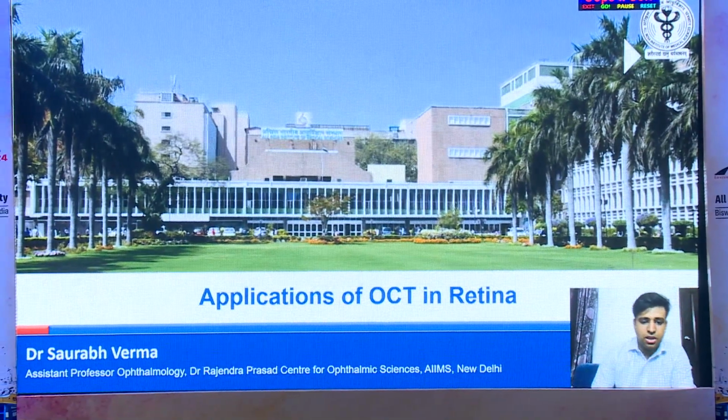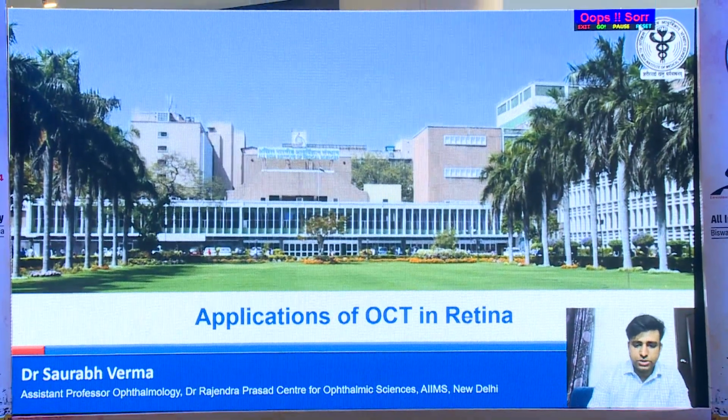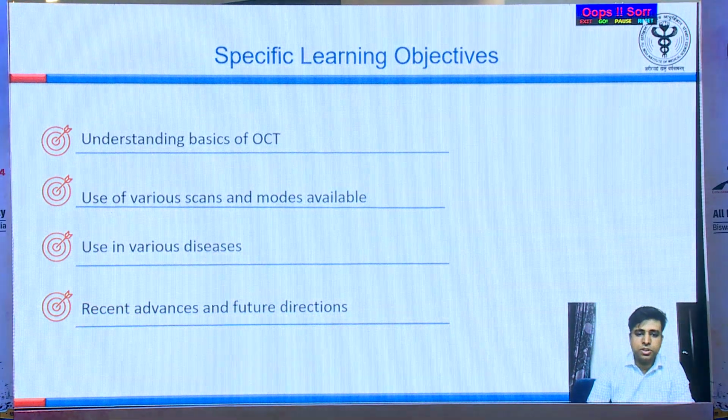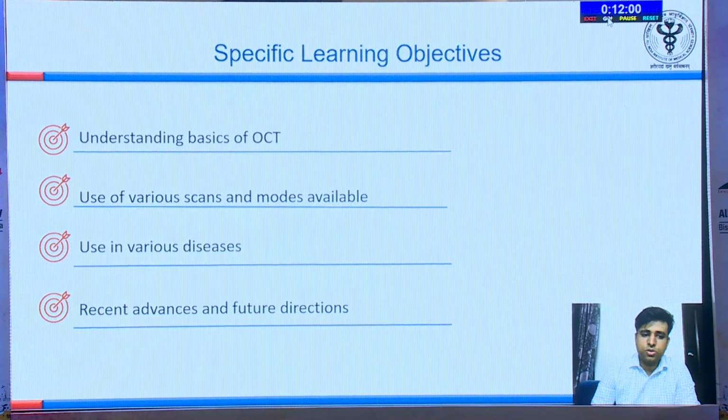Morning everybody, I'm Dr. Saurabh Verma and we'll be talking about applications of OCT in retina. In this presentation, we'll be going through the basics of OCT, use of various scans and modes which are available to us in diagnosing as well as treating various diseases, and go through recent advances and future directions.